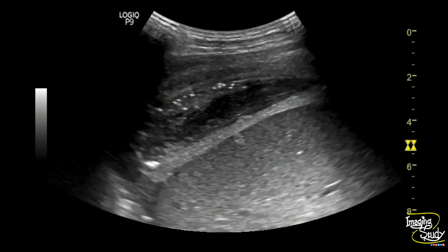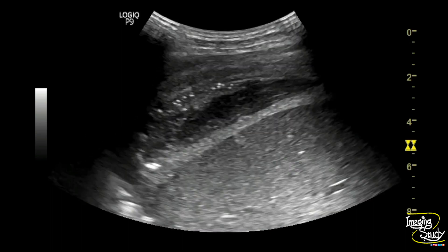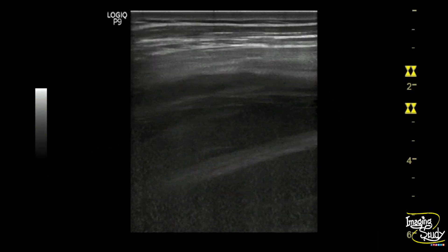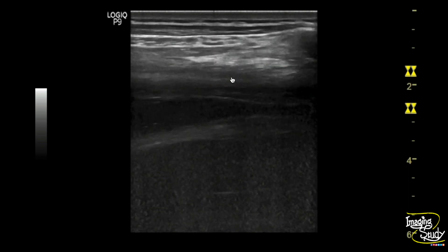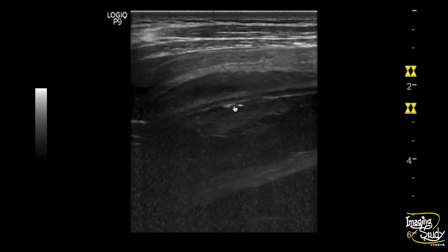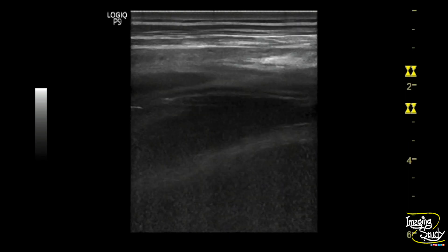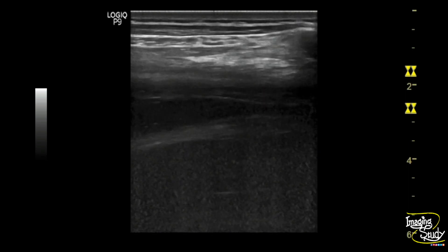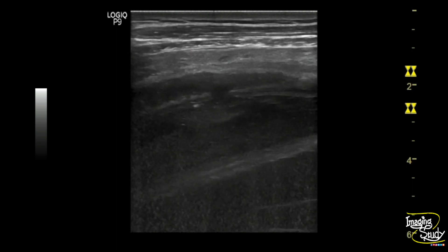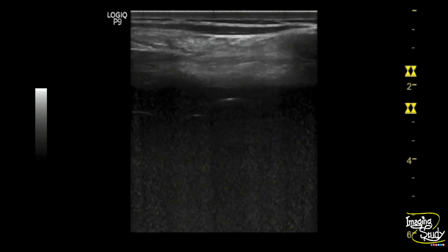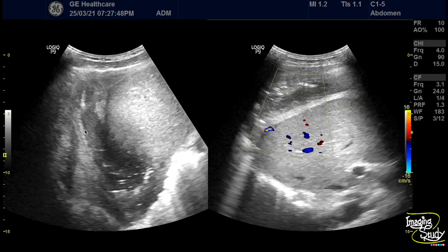Let's see what we have on the linear transducer. Here is the linear transducer view and you can see the thick margin of the abscess is well visualized here, and echogenic air foci are also seen within. Here is the picture of the abscess from the intercostal view.